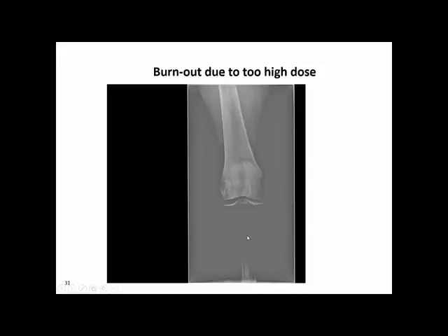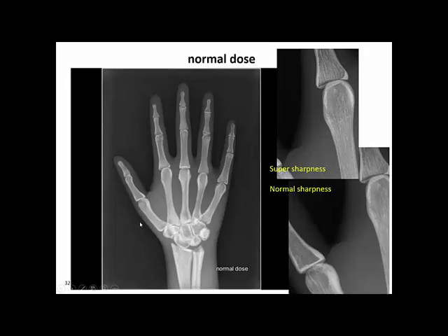It's like the digital camera. If you would like to make a photo of the bright sun, it will not be possible, because our sensors in digital cameras also have a limit over which we have overflow, and this is a very good analogy to DR technology. We have tools that would warn the operator, the exposure index, which I will be coming to later. Obviously in this case the operator didn't care about the exposure index or the dose, and then this happens. In the normal range, here we see what a normal setting would be in a very successful way.